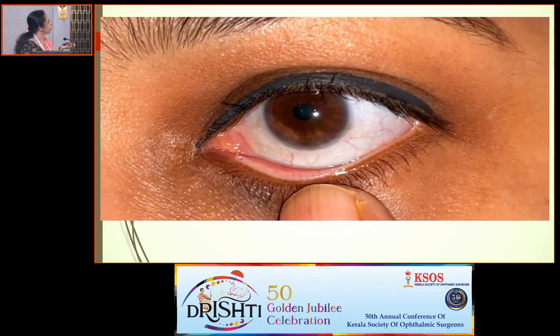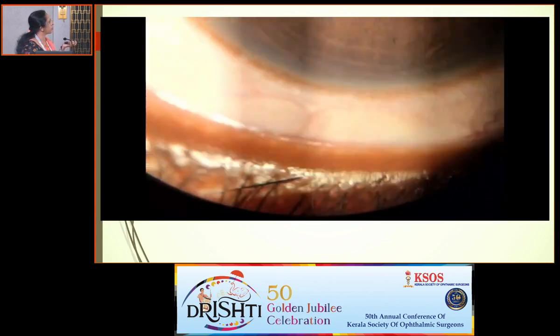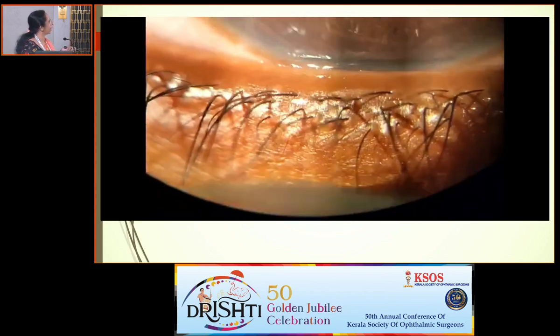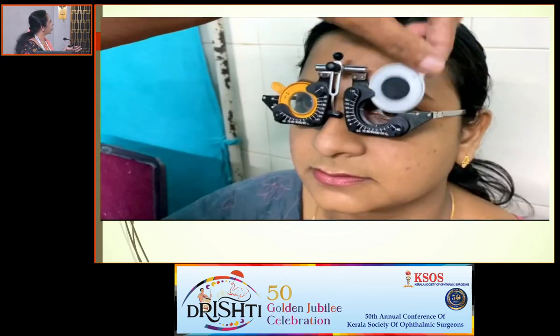Now this is a push-up test. The lower edge of the contact lens is pushed up, and you see whether it comes back down freely. This also has to be done. When it is moving very freely, the lens will come off otherwise.